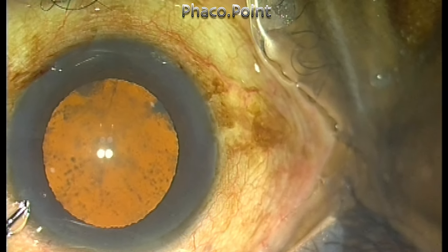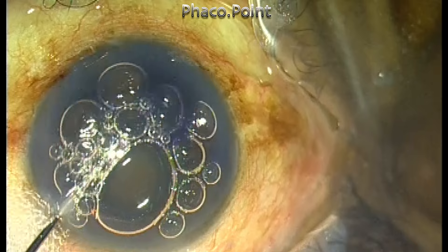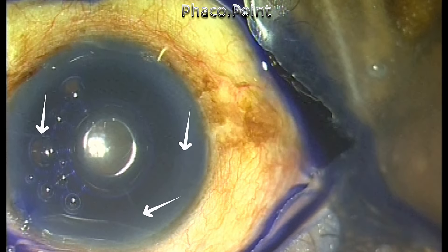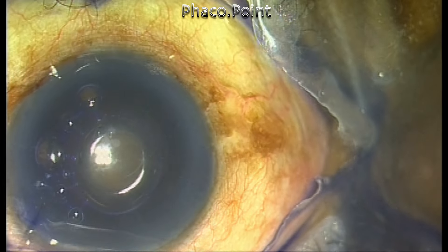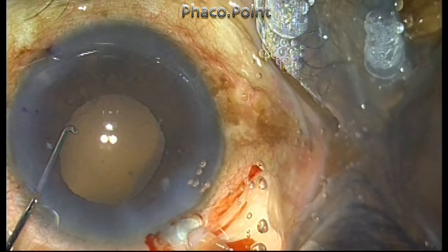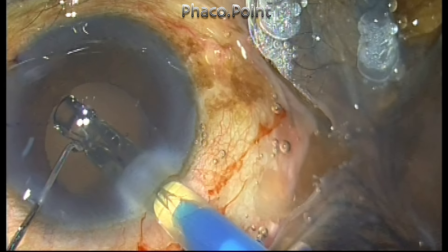In this case I'm going to implant a toric hydrophobic acrylic lens. For those who have marked the cornea either with a 26 gauge needle or with a hockey stick blade, a simple trick is the use of trypan blue in the anterior chamber, which helps increase the visibility of the markings. This is a pre-loaded hydrophobic acrylic indigenous toric lens.